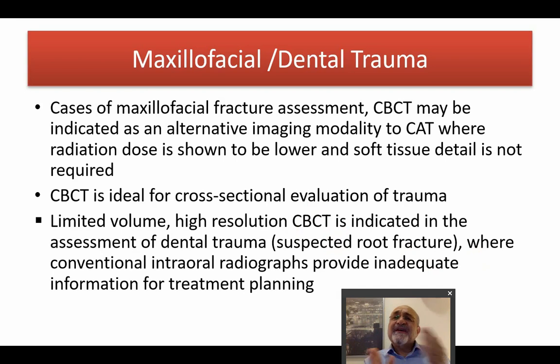Quick exposure is for cases where, suppose you're doing an implant and you want to see a quick 3D view, so this will be done with a reduced exposure time. In cases of primary evaluation, though, you don't try to use the quick exposures, go to the high dose exposures, so that you will see high resolution images, of course at the expense of the patient exposure.